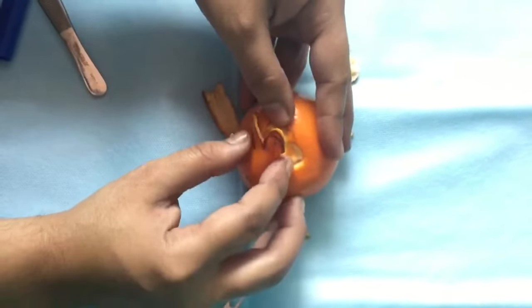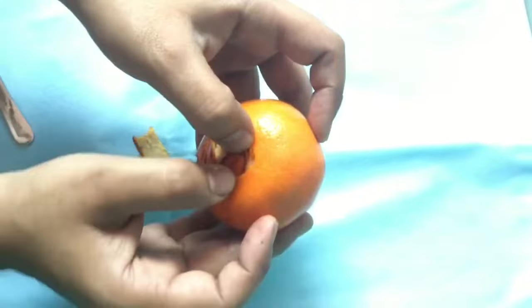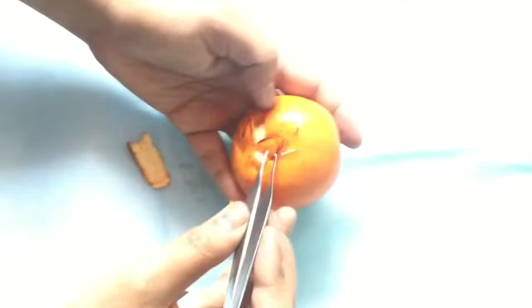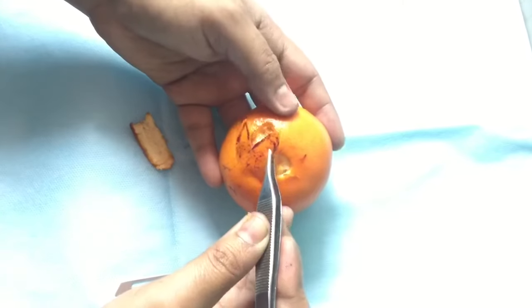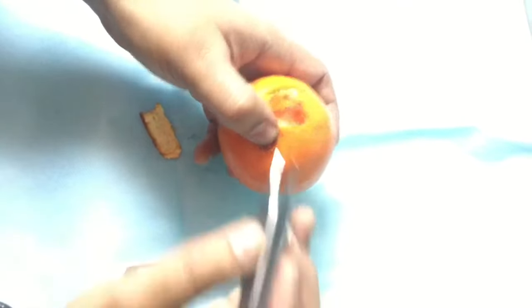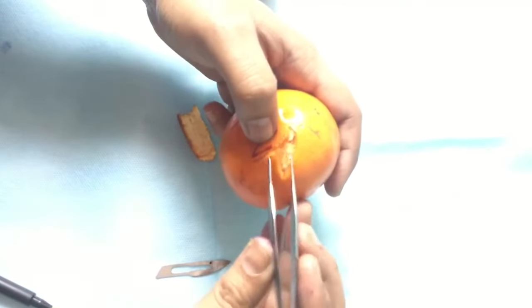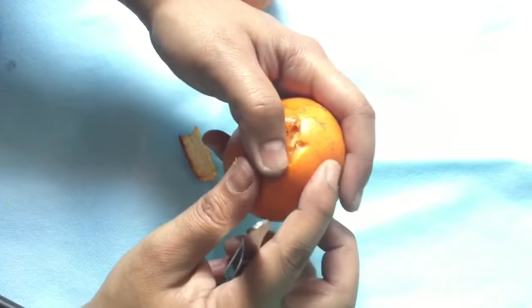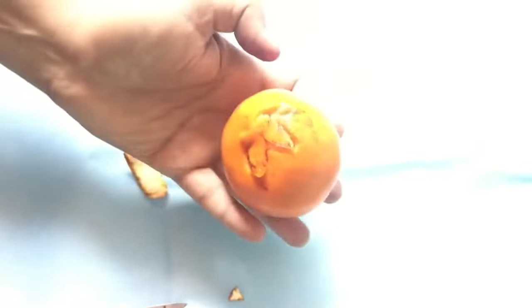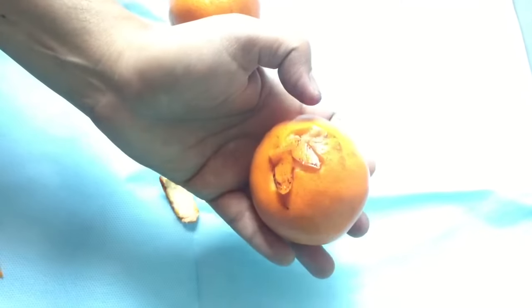Now I'll rotate the flap — this thing will go here, this thing will come into the defect. You can see the defect is nicely closed with this flap. This part goes into the defect and gets sutured there, and the secondary defect gets closed primarily. That is your bi-lobe flap. There are specific angles to these flaps which I haven't gone into in great detail.